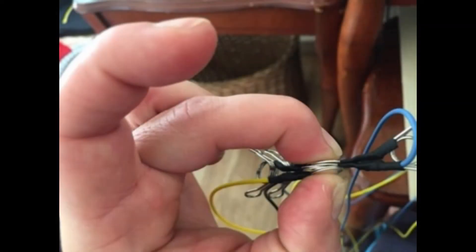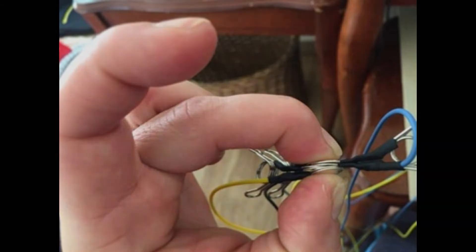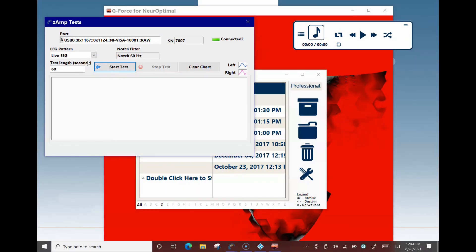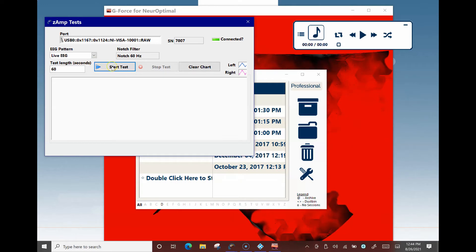Next, stack all of the sensors tightly together between your thumb and finger. Left-click or single-tap Start Test.